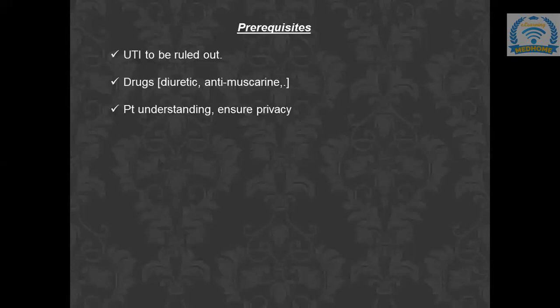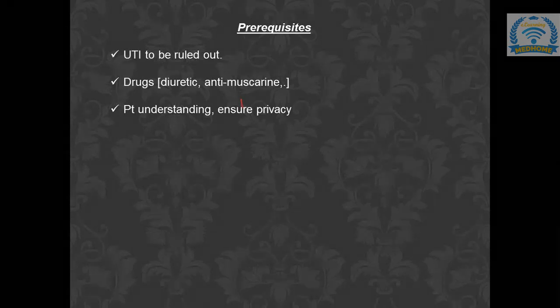And the other thing is that we need to inform the patient, we need to explain the procedure to the patient, what we are going to do with her. And very important, we need to maintain the patient's dignity and respect. It's very important because we are going to do a test that is a very sensitive issue. We are going to deal with a woman with incontinence, which needs to be dealt with very sensitively.